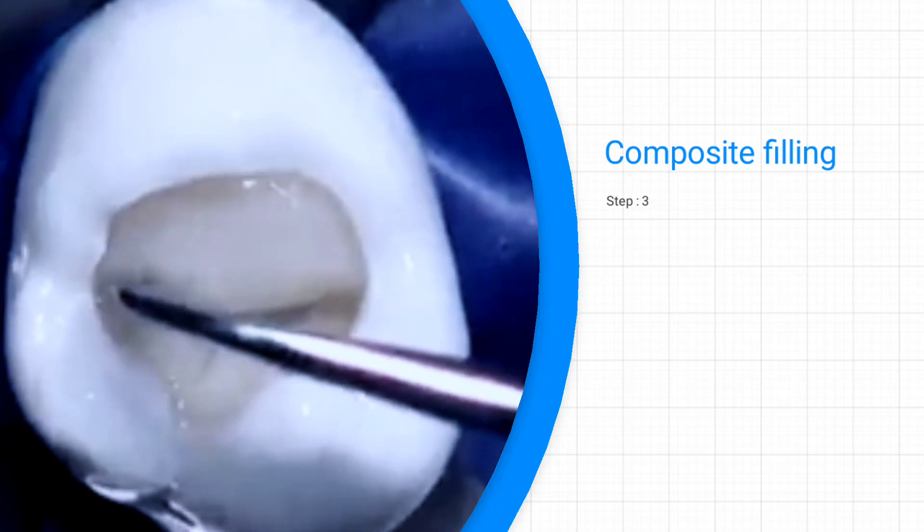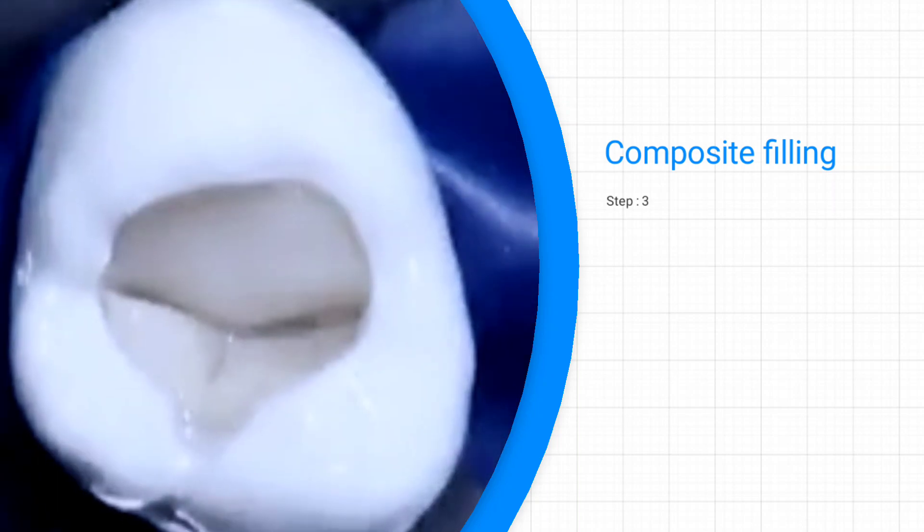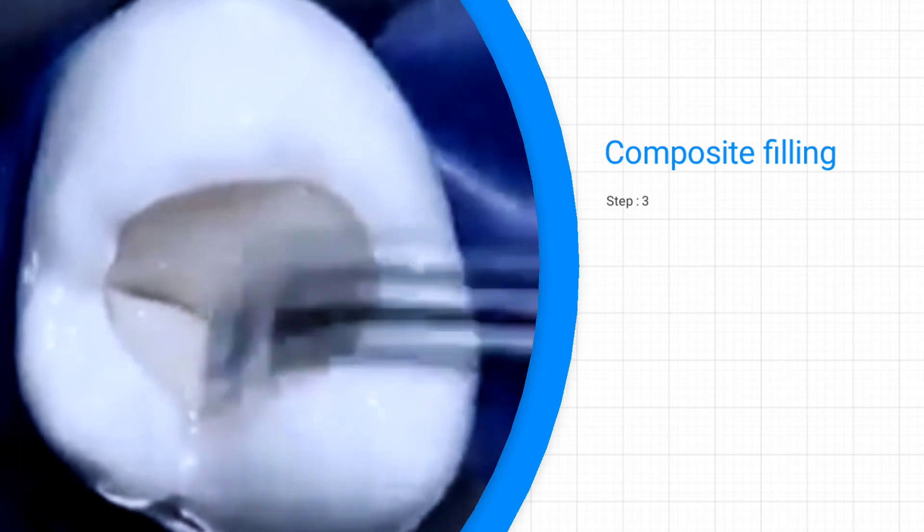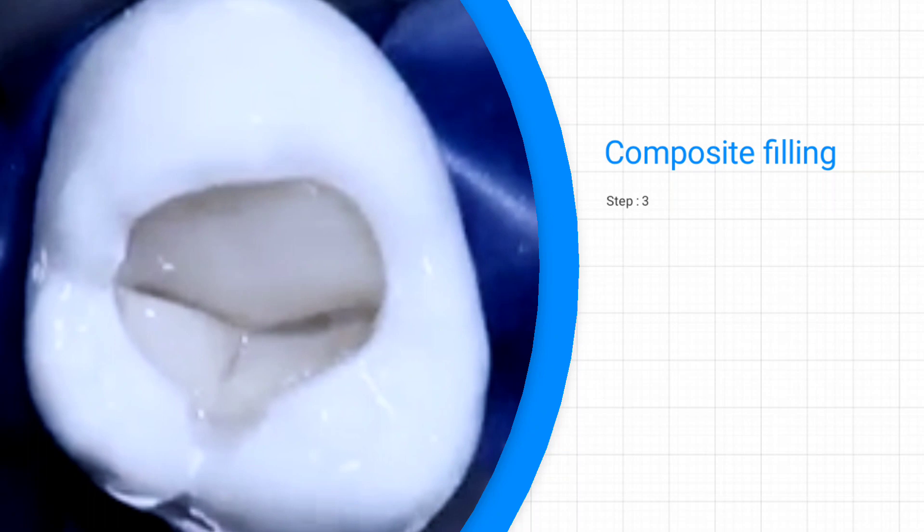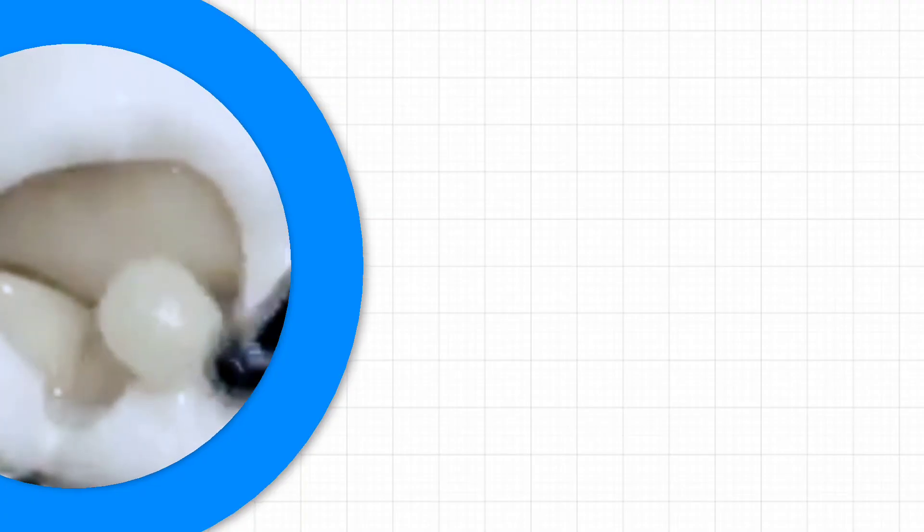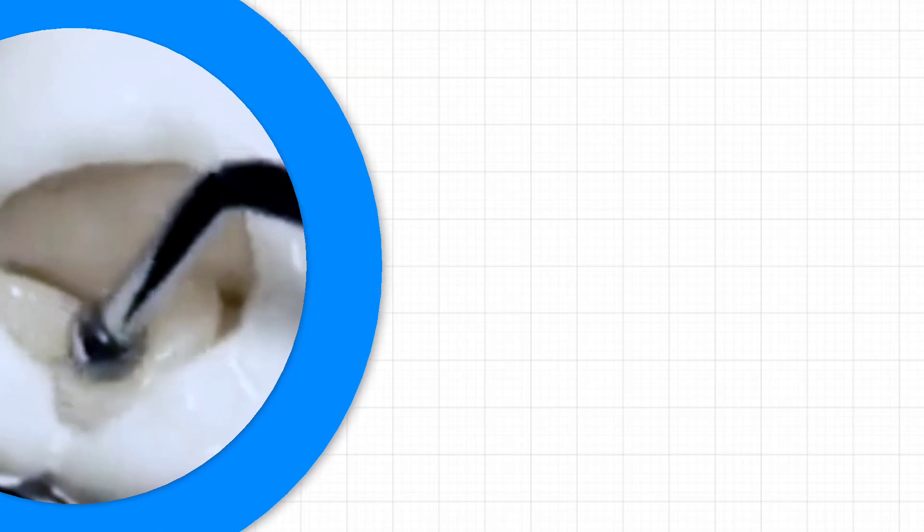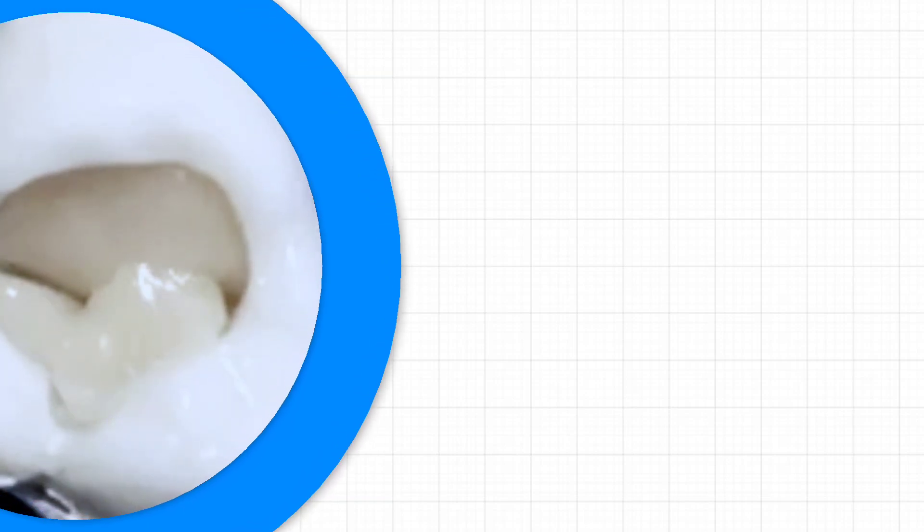Apply composite in layers, so each layer attaches to the bonding agent. The composite filling looks like and feels like a putty. Apply a flat layer into place, and after this, expose to the curing light for about 10 to 40 seconds.